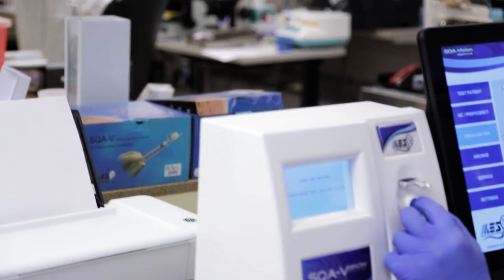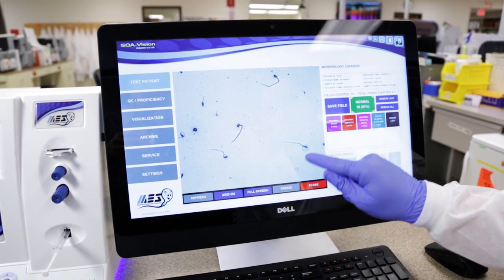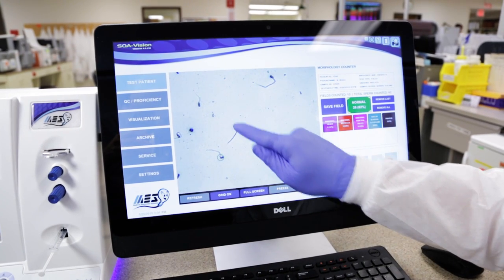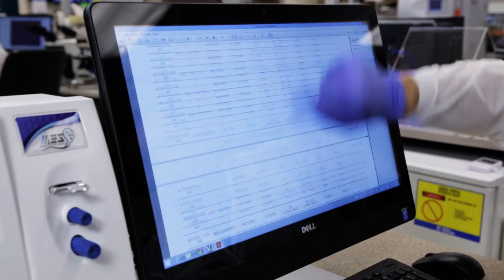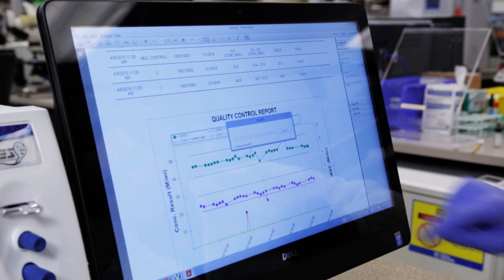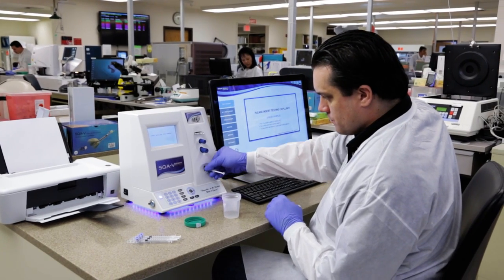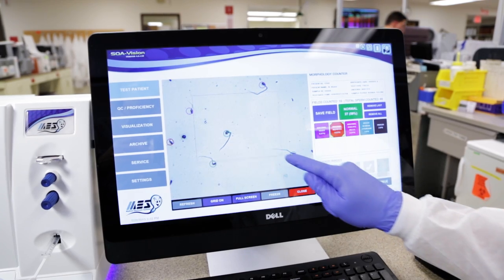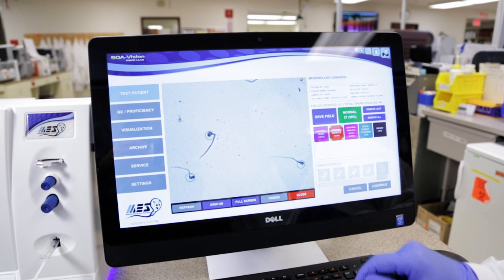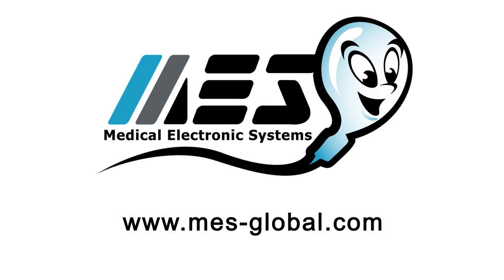The SQA Vision is an incredible semen analysis solution for anyone testing semen samples for fertility screening, post vasectomy analysis, sperm banking, or IVF preparation. It combines the objectivity and speed of automation with the technologist's judgment and skill to deliver the most accurate, objective, and reliable semen analysis test possible. For more information on the SQA Vision, please contact us through our website at www.mes-global.com.